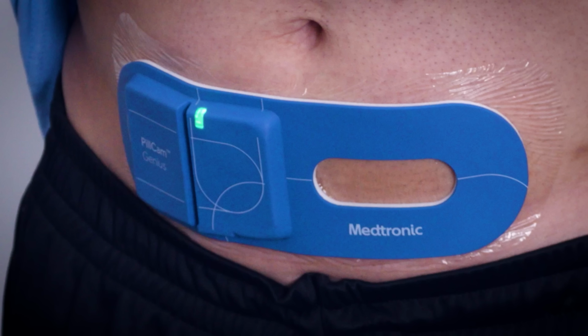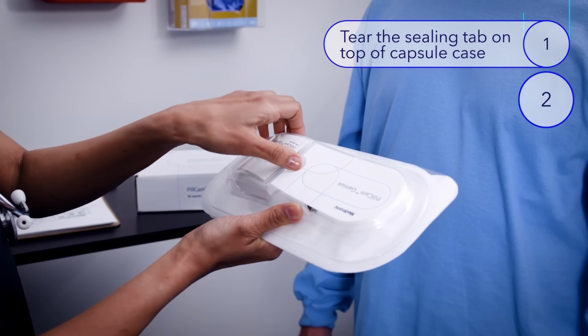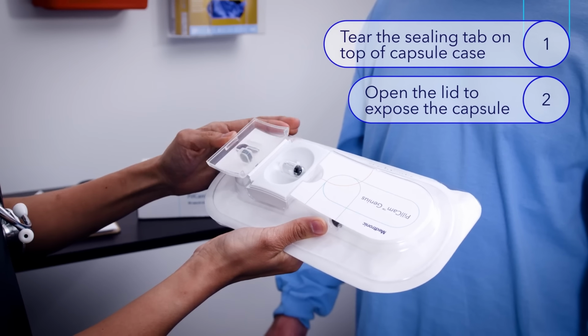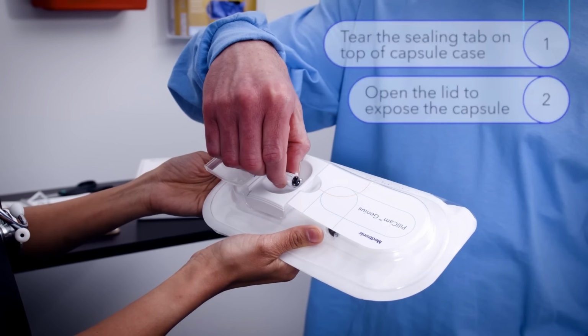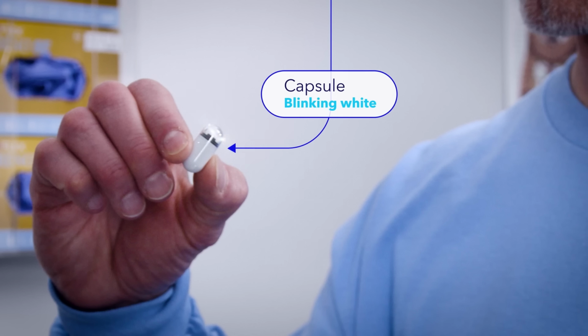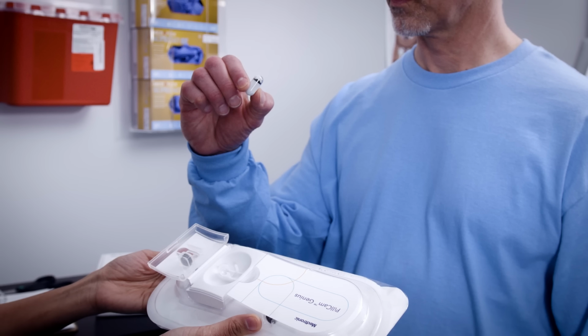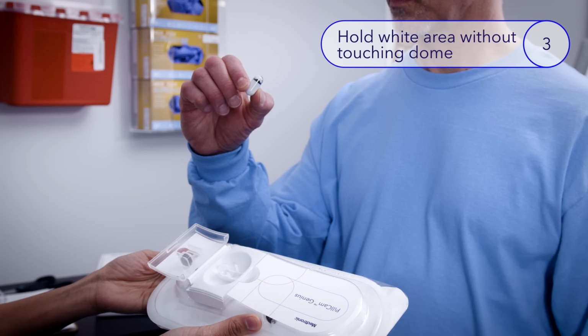To access the PillCam Genius SB capsule, tear the sealing tab on top of the capsule case and open the lid. Opening the lid activates the capsule and causes the capsule LED to blink white. Instruct the patient to gently grasp the white area of the capsule with 2 fingers and carefully lift it out of the packaging without touching the transparent dome.